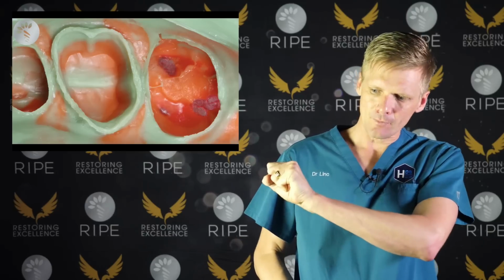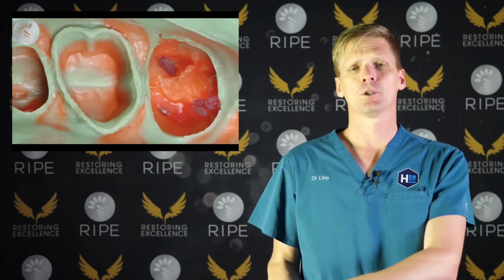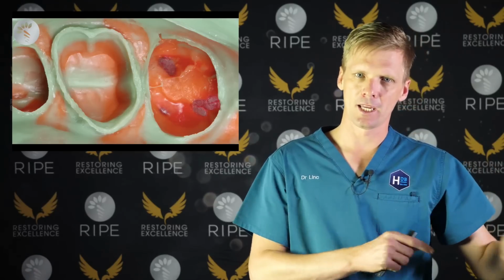And then once you've pulled all the cords out, this is for say 10 preps, pull all the cords out, tell the assistant to start filling, they say halfway. By then you'll have injected light body everywhere. So choreography between you and the assistant for filling the tray is quite important.